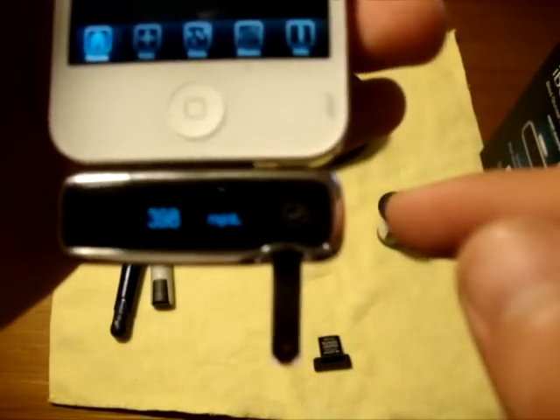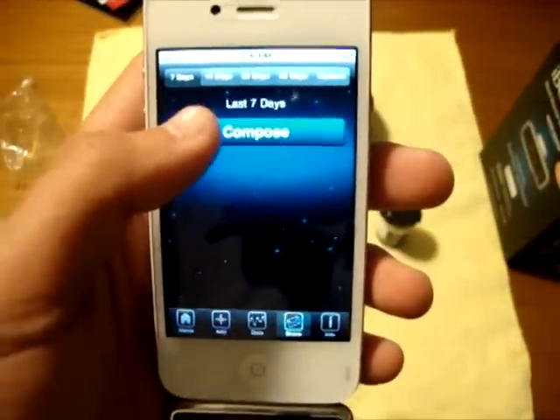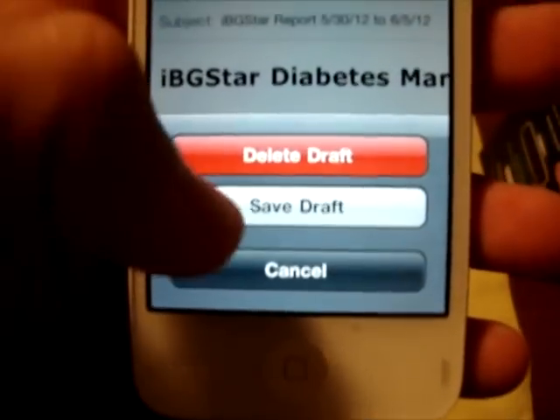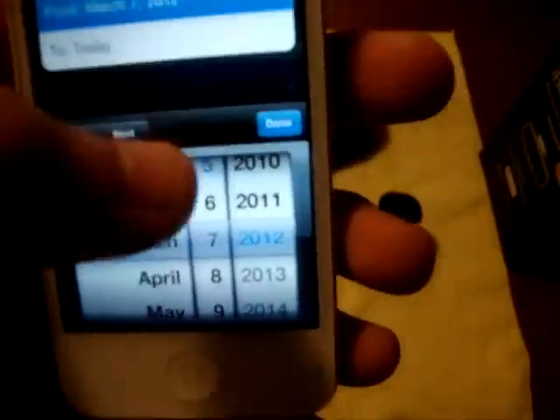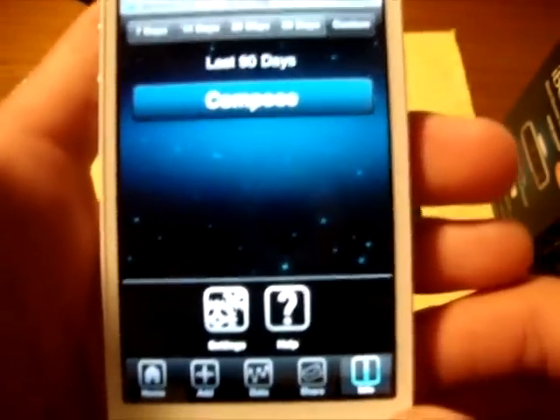It shows the reading on the device too — milligrams per deciliter — plus the time that I tested. You can add tests if you tested on a different device and still want to log it. You can check out your data: it can set up a graph, a trend chart, a logbook, or stats. You can also share data with other people via email — sending a PDF of all your statistics with really cool breakdowns like pre-breakfast and post-breakfast. You can send spans of 7 up to 90 days, or a custom date range. You can even email it to your endocrinologist right in the office. And there are settings and help sections too.